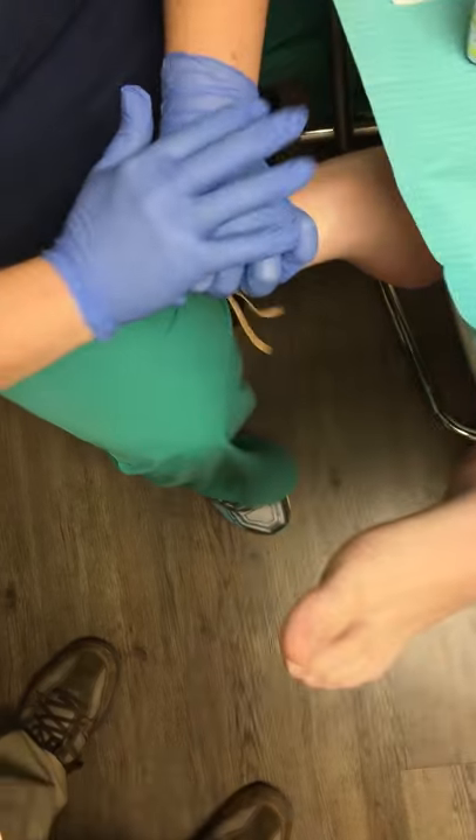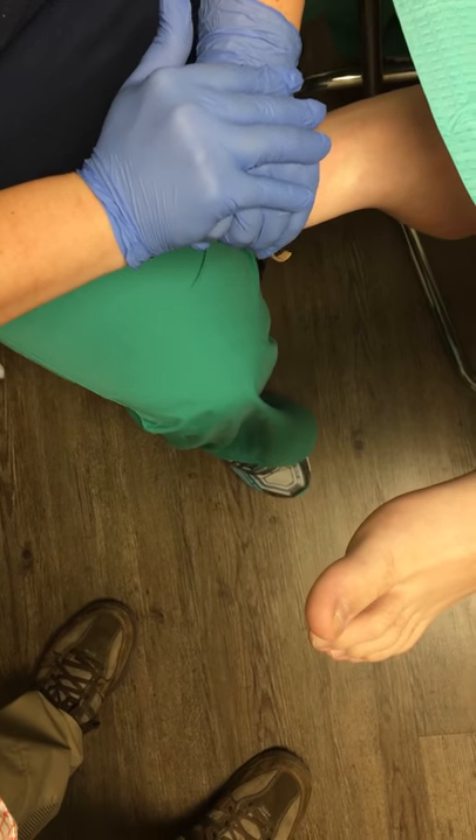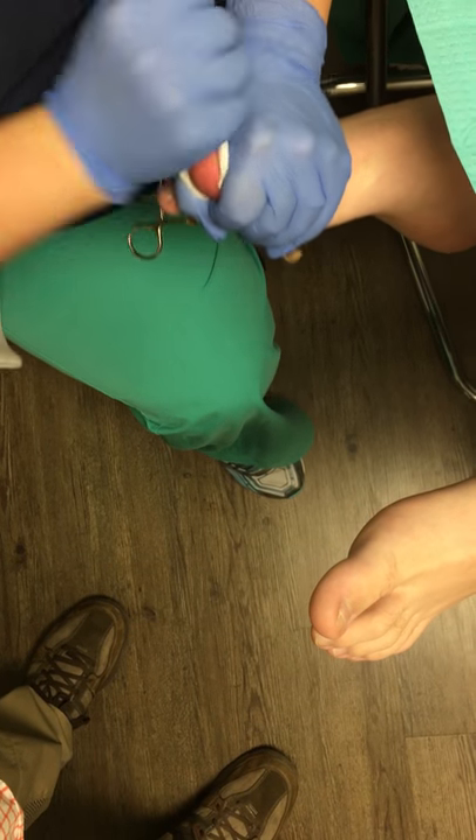We like to use band-aids to help cut off the blood flow to the toe, but there are actual toe tourniquets that you can use. They usually are a green color, and you just slide them down the toe.